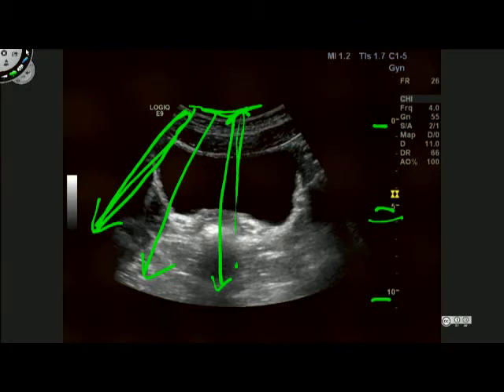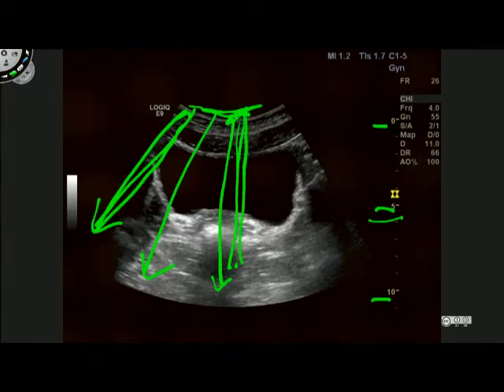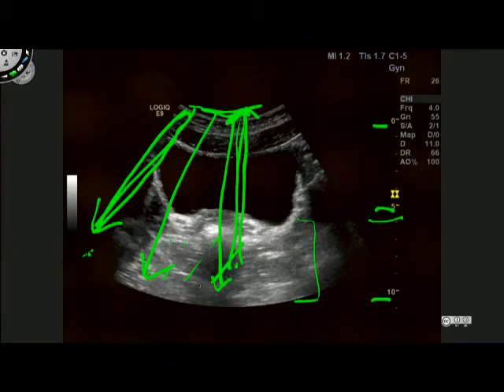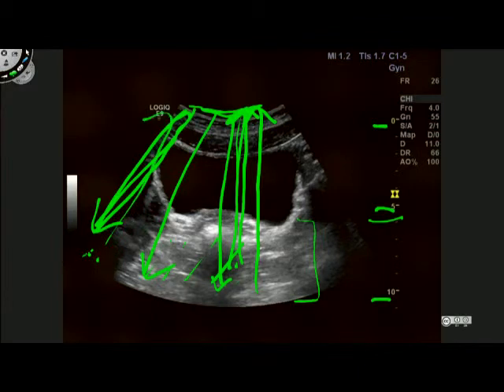Whereas sound waves passing through this area, because they pass through a distended urinary bladder full of fluid, when they come back to the transducer they have a much higher signal associated with it. If you look beyond the urinary bladder, in this particular area, you can see that this area is a much higher signal than this area out here, because the sound waves have passed through the urinary bladder here and not through the urinary bladder over here.